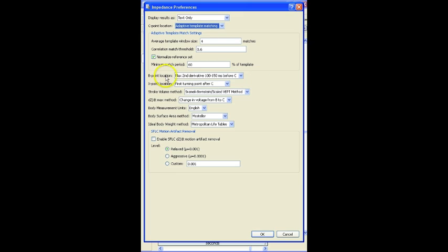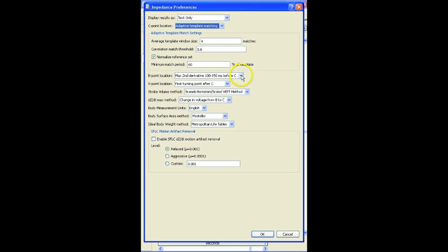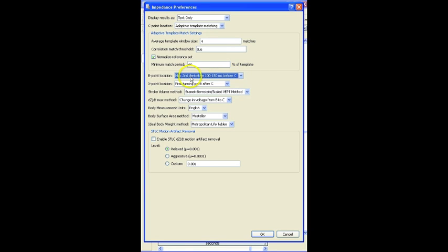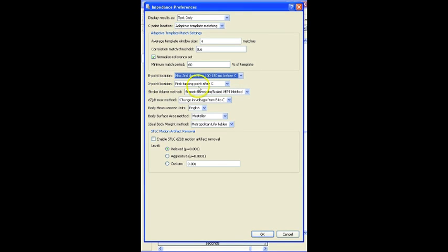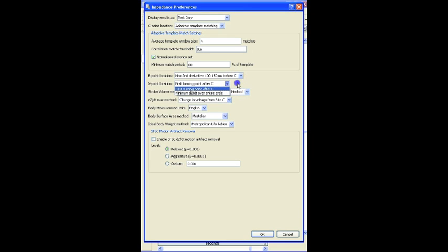Now beneath that, you've then got some options for the method that's being used to identify different points in the data. So the B-point location, either the maximum second derivative, 100 to 150 milliseconds before the C, max third derivative, the first mean. Again, the default usually works pretty well and you shouldn't really have to change these options unless the algorithm is unable to reliably mark the points on the complex. X-point location, we're using the first turning point after the C, otherwise you can use the minimum DZDT over the entire cycle.